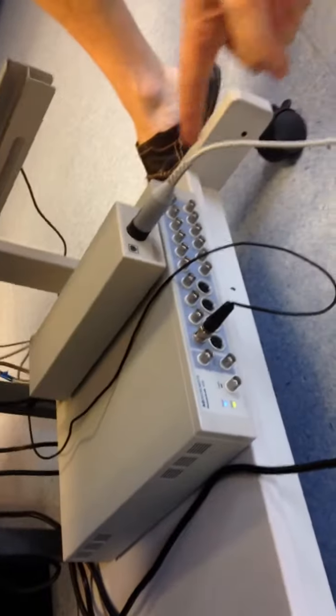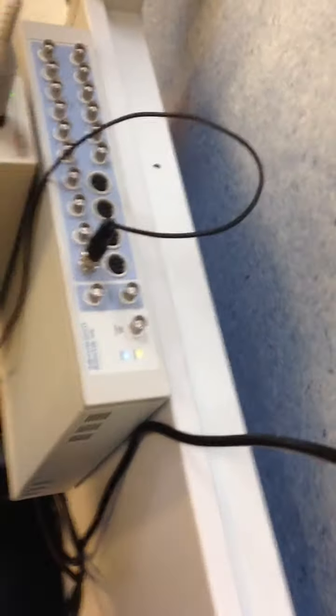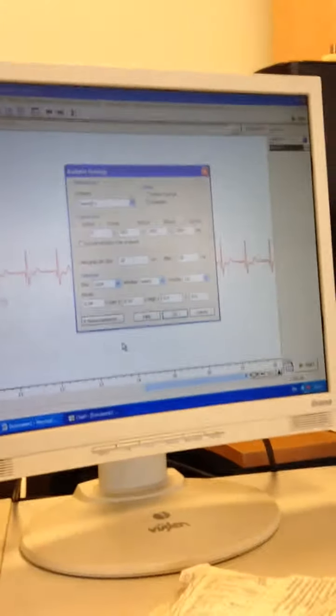So you should be able to see in the top left, it's telling you it's on channel 1. That's why you're picking something up, because it's plugged in down on the box here. If you put the plug in the wrong place, the channel numbers might be the only reason why you're not seeing anything. Yeah, I see it. All right, this is another troubleshooting thing.